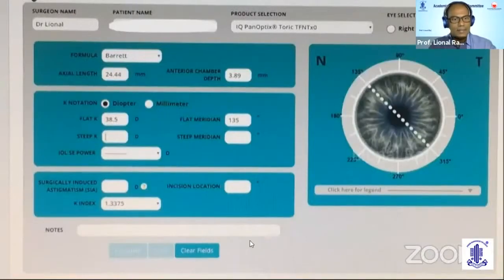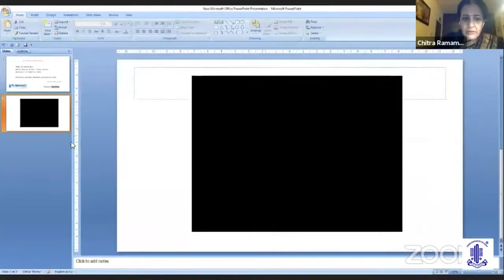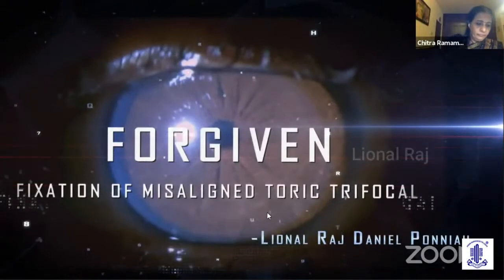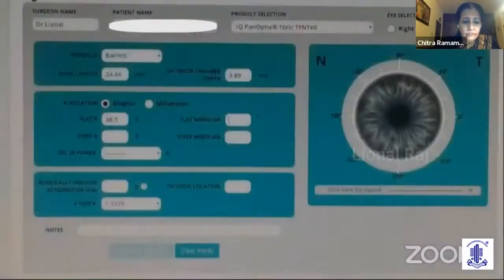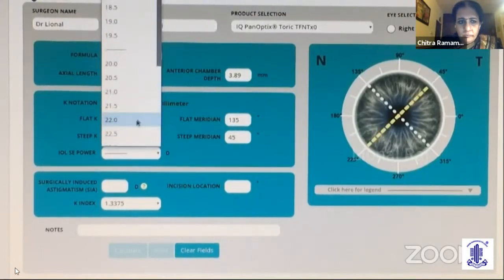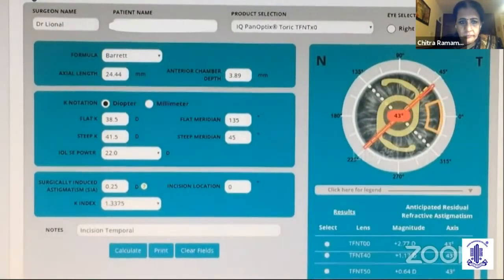Toric trifocal implant. A 44-year-old male with dense posterior subcapsular cataract was taken up for cataract surgery with a toric trifocal implant. An online toric calculator was used with Barrett's formula. Based on a flat meridian of 135, steep meridian of 45 degrees, and IOL spherical equivalent of plus 22 diopters, a TFNT60 model of IOL with 43-degree fixation was planned.